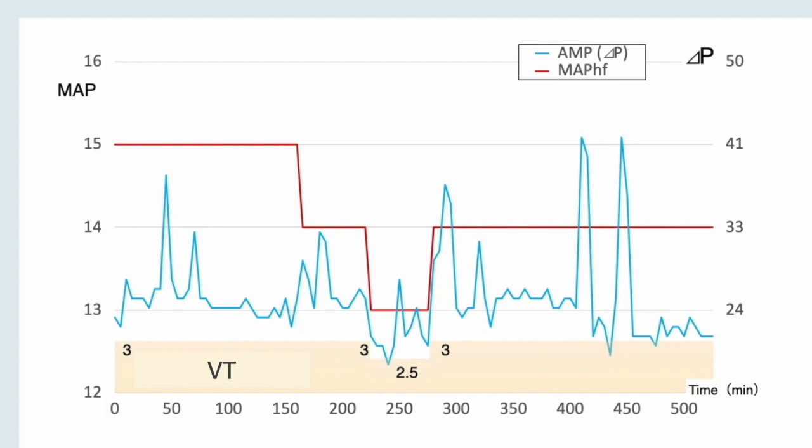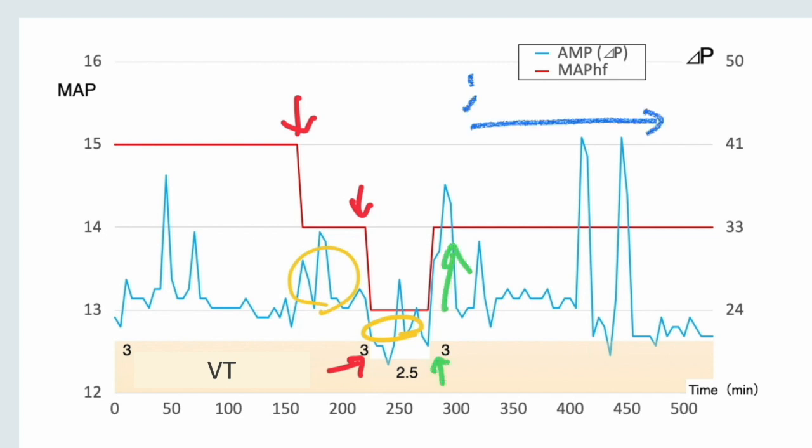The graph including the 3 parameters makes it easy to monitor the changes. Although the MAP is lowered and the tidal volume is lowered to indicate that oxygenation and ventilation have improved, the actual amplitude has increased, indicating that more pressure from the ventilator was needed. Subsequently, increased MAP and tidal volume did not immediately decrease amplitude. Higher FiO2 was needed, and nitric oxide inhalation therapy was required.